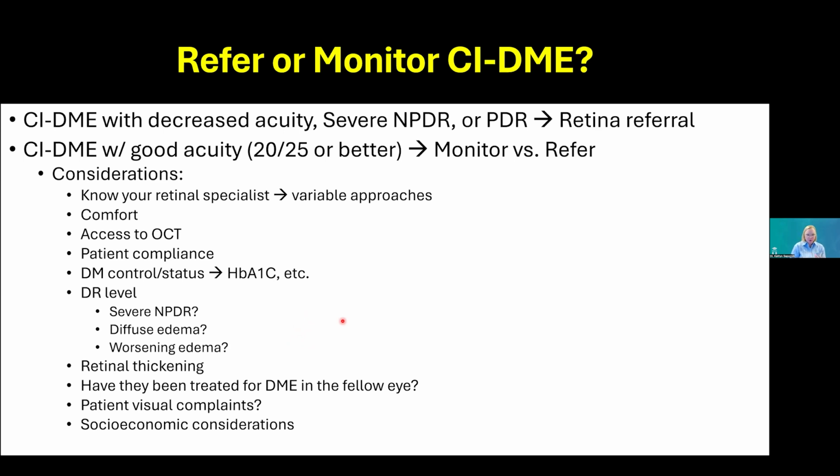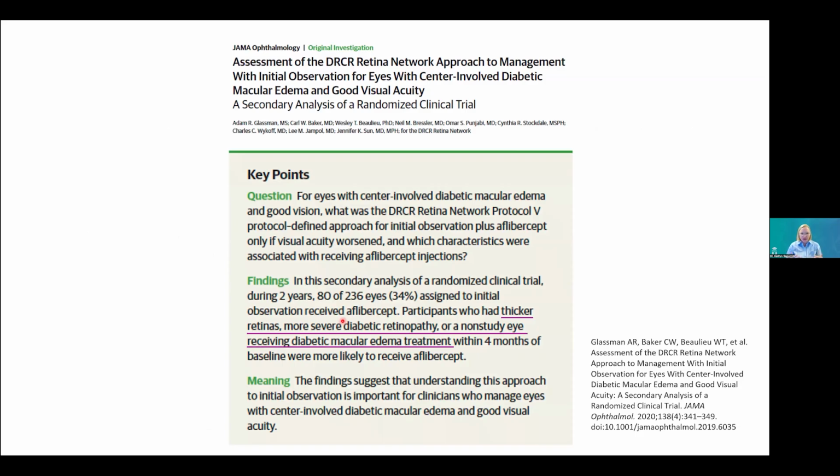So sometimes with the ones where I have a hunch that they're going to progress and lose vision, I'm going ahead and referring them to retina so they don't waste their time with me at the next visit, and they get in for that retina consult and can get treated a little sooner.